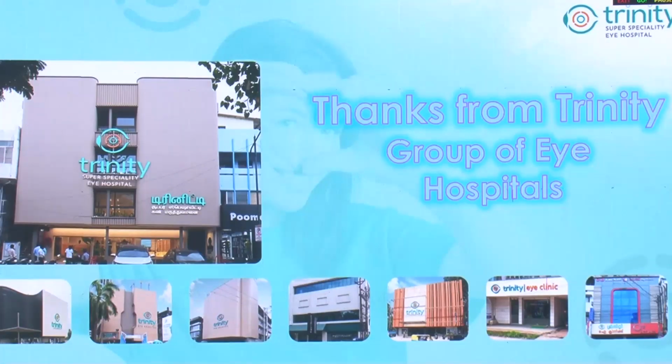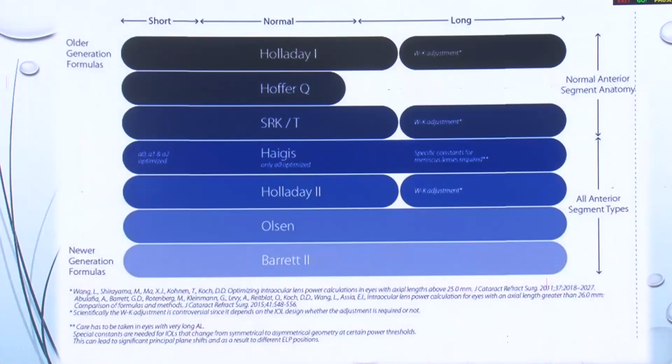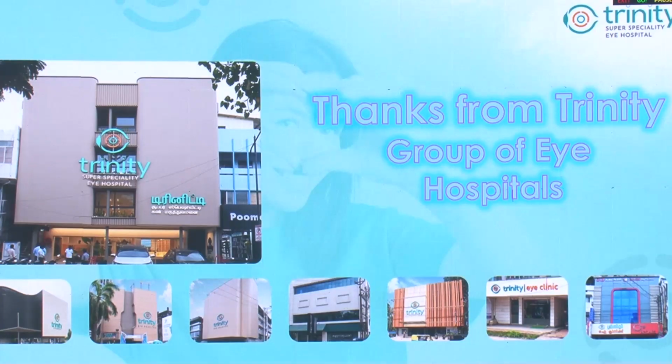So this is the chart. I think most of us have seen this. Last, you see the Olsen and Barrett 2 is good for all cases, and Barrett 2s are not available in basic machines like optical biometers. So what I used to do is take the reading, send it to the company and ask them to calculate with the Barrett formula, and we use that. So I think we can conclude with that.